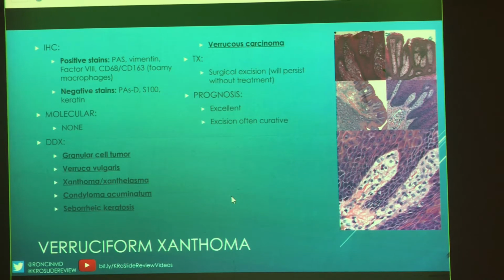For treatment, they will excise these surgically because they don't go away if you don't take them out. And remember, these aren't related to your lipid levels, so we don't manage them medically. We're just going to cut it out. And that's often curative, and these have excellent prognosis because they are completely benign. And that is your verruciform xanthoma, a great mimicker of verruca and condyloma.